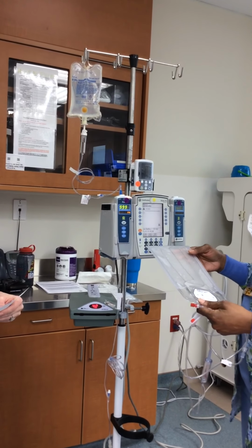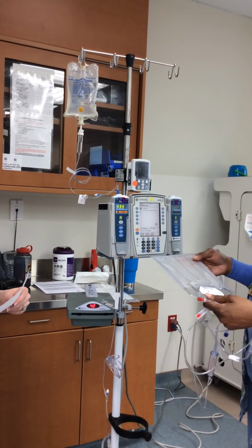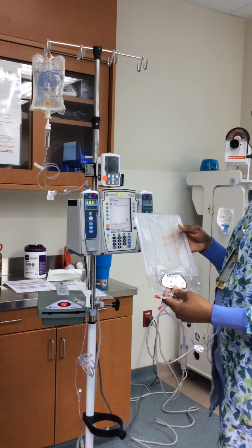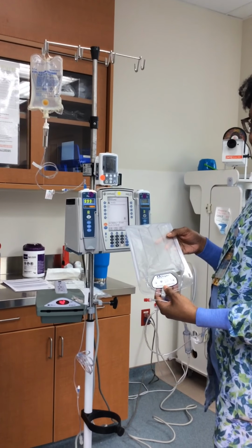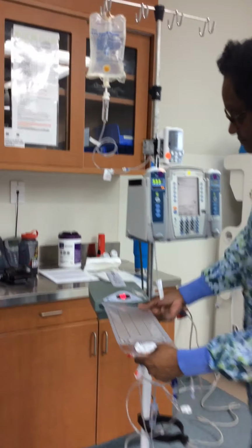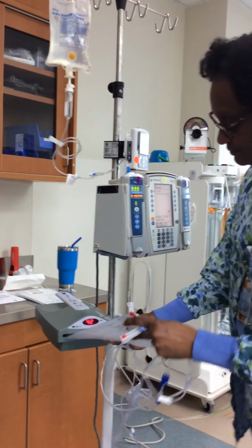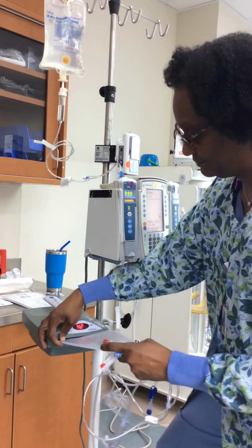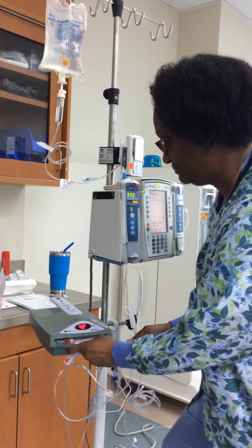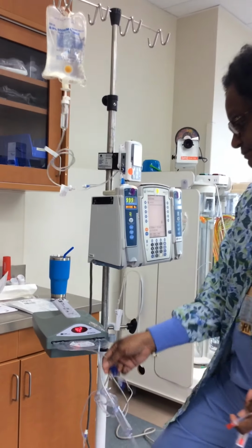So first thing to do, the cassette has to be empty to be able to use it. Make sure when you pull out your cassette, the logo is facing up and it is empty. It will then slide into the front of the machine. Make sure it's empty. It gets empty going in and empty coming out.